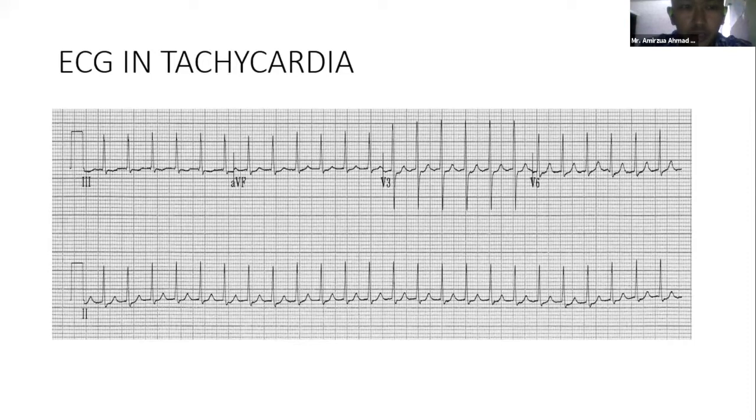Usually, the patient comes with an ECG in tachycardia. Some patients are narrow but irregular, but we don't go for a three-wire EP study. For example, in this case we have a narrow regular tachycardia on ECG. So this ECG may be AVRT or AVNRT. And some patients have extra data from the referral letter, such as termination with adenosine, so we suspect an accessory pathway. It can be AVNRT or AVRT.